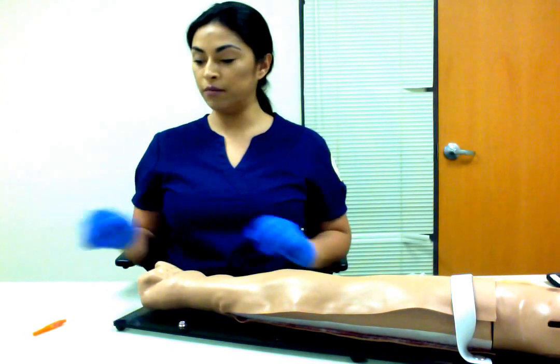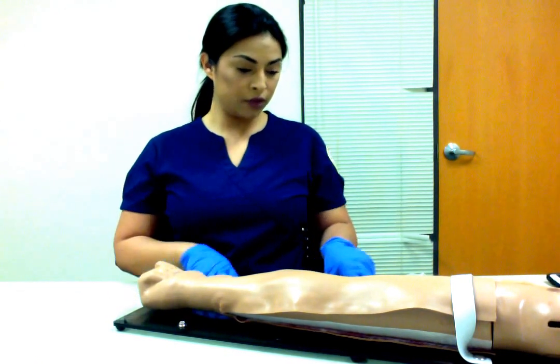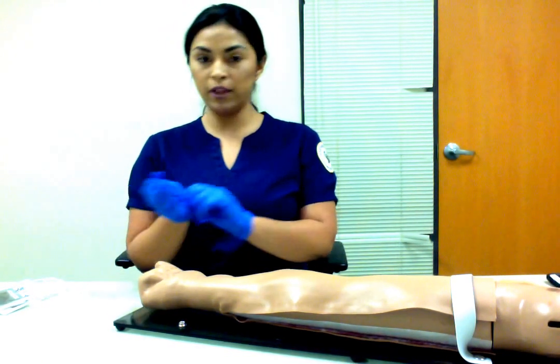Then you can toss the needle into the sharps container, clean the area, dispose of any of the equipment that you used, and remove gloves.